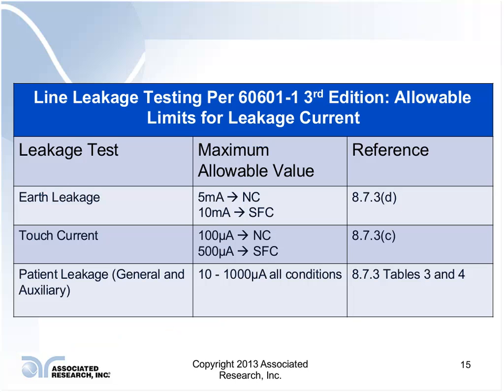So what types of limits does the standard allow? Now, fortunately, in this case, the standard does outline very specific limits on exactly how much leakage current is allowed, which is nice because it takes the guesswork out of the equation. It tells us exactly how much we can have maximum, and if we exceed that value, it would be considered a failure.